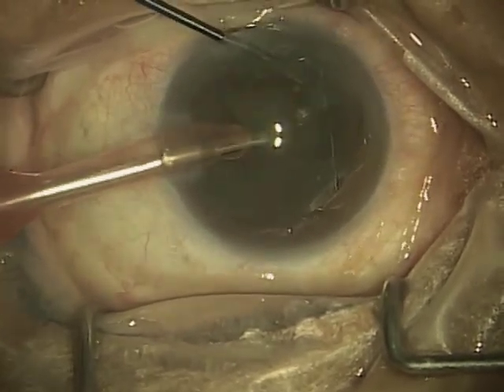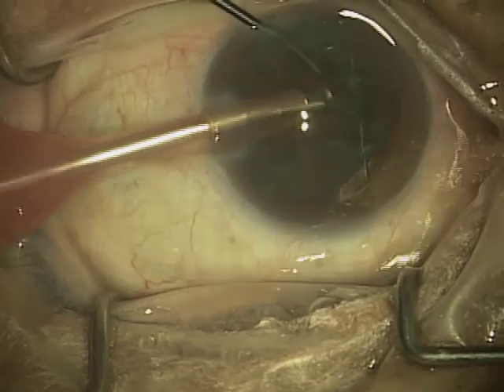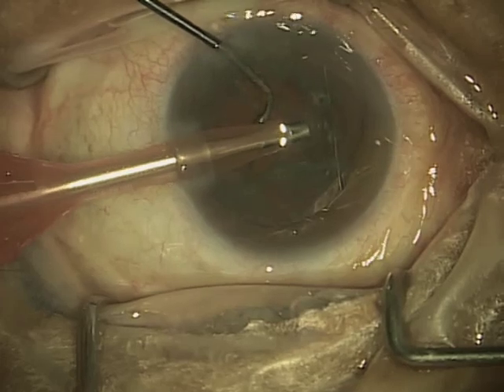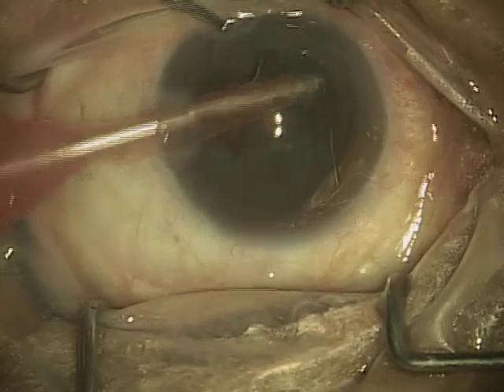As you can see here, the phacoemulsification is going on. And this part of the surgery, although it's the bulk of the surgery, does not actually take as long as all of the preparatory steps.